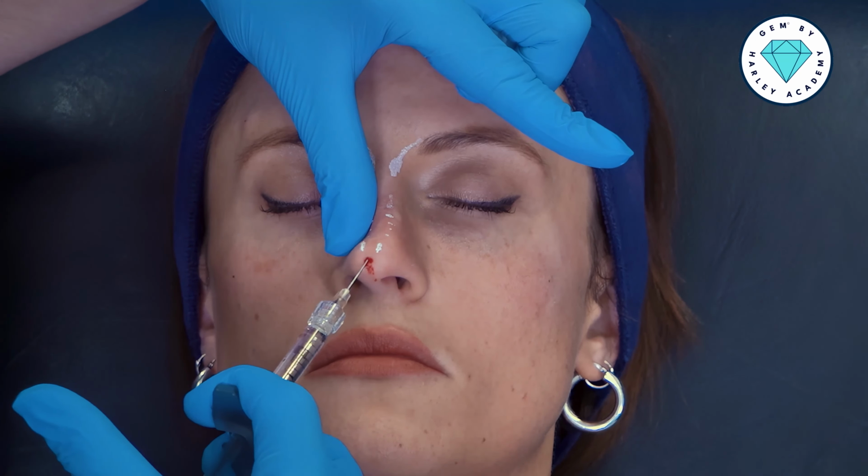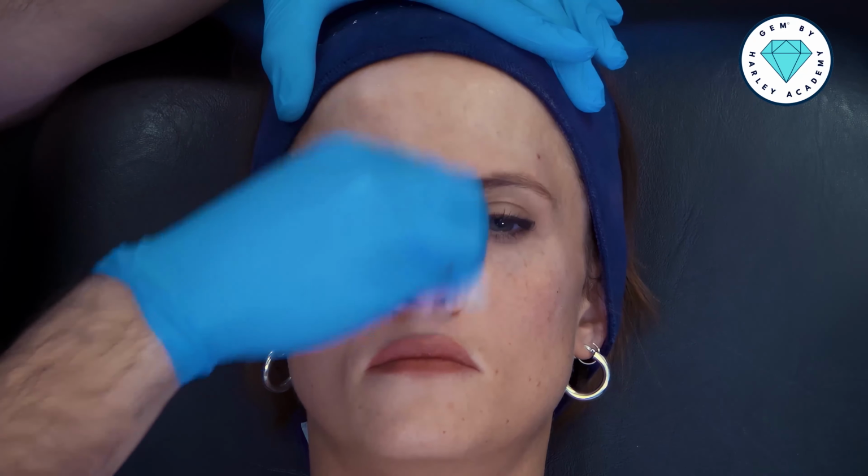And now we can review our progress. I'm now going to take off all the lines because we don't need them anymore. We're going to move to refinement now.